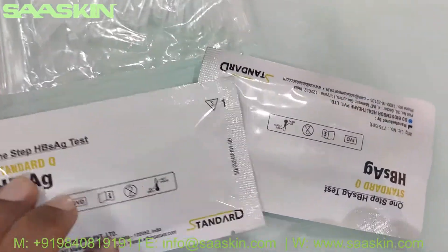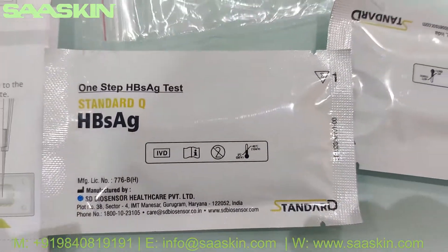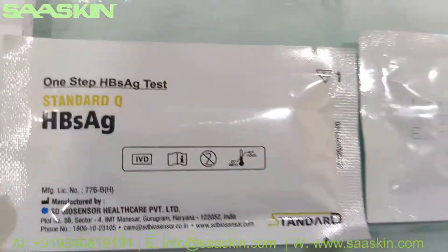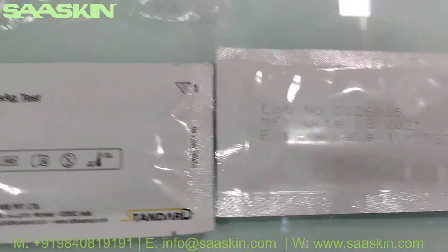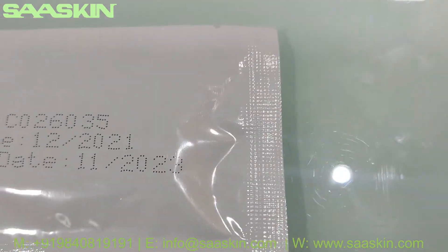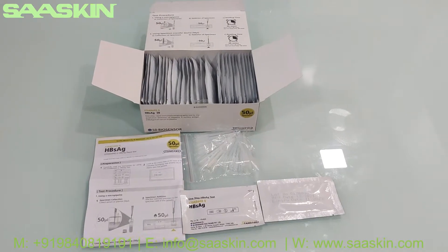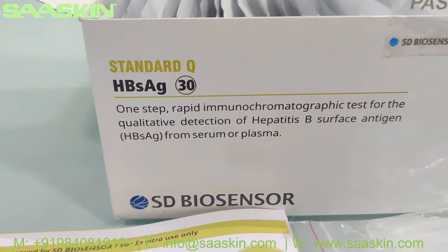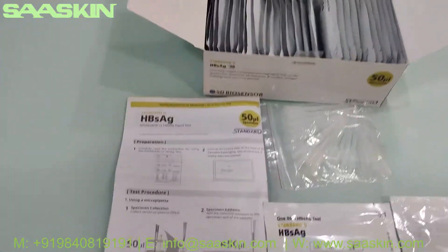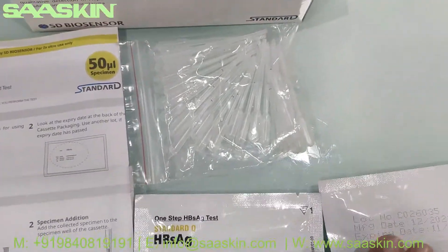This is how the test cassettes look like, front and back. On the standard, all these tests have a two-year expiry. So to give a quick summary: the Standard Q HBsAg test kit — the antigen test kit — for serum or plasma contains 30 test cassettes, 30 specimen transfer devices, and one instruction manual.